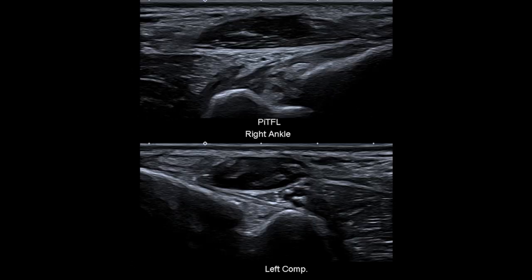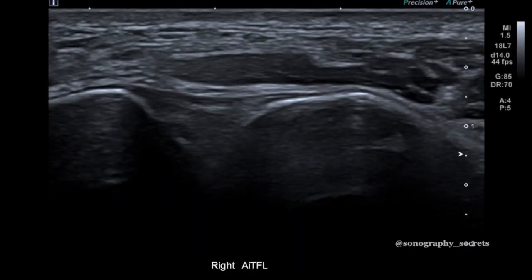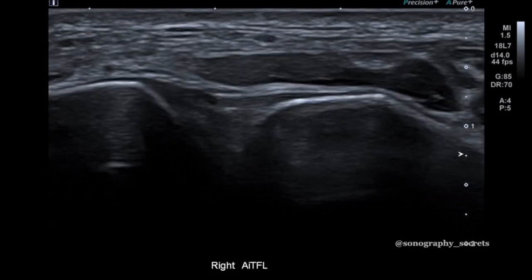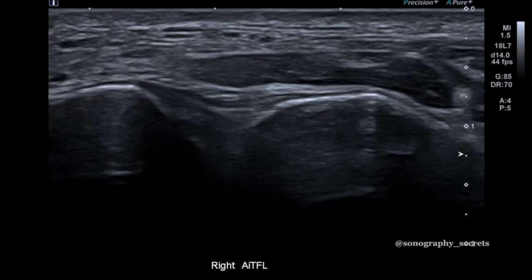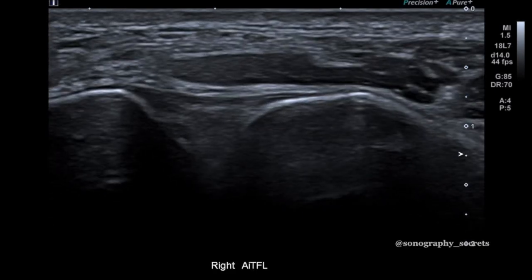confidence. And the most important component of the syndesmosis is the AITFL. You can have a torn AITFL and an intact PITFL and a normal interosseous membrane, and this will still result in a surgical tightrope repair.